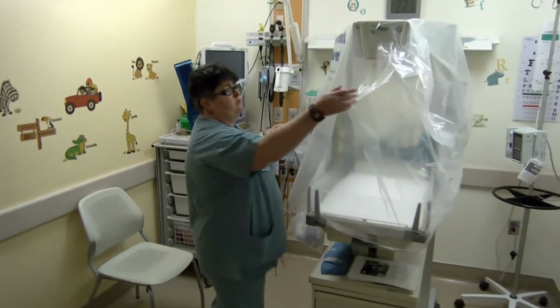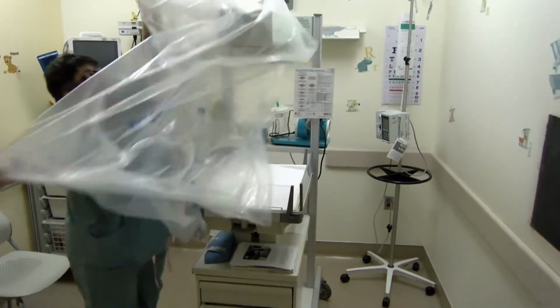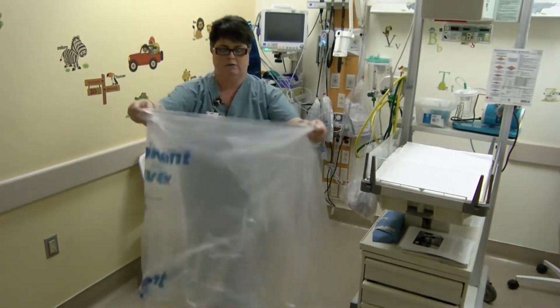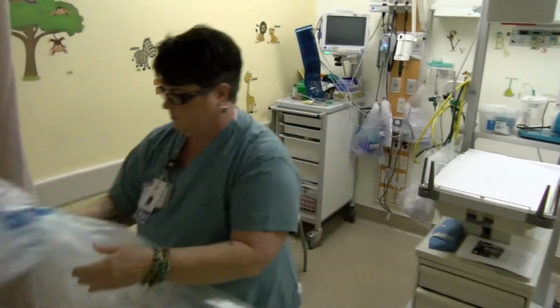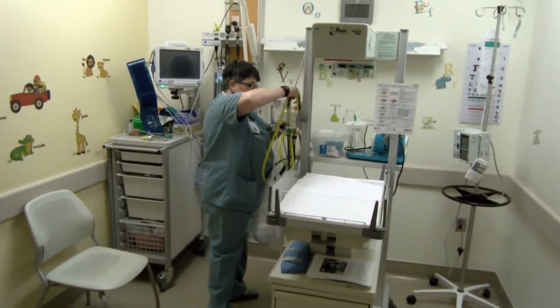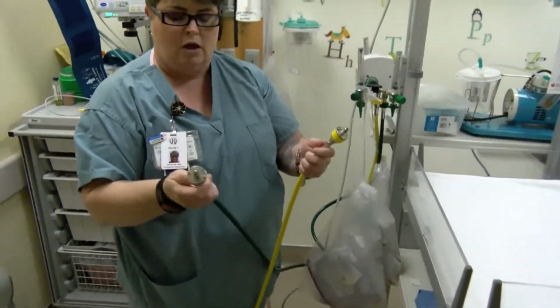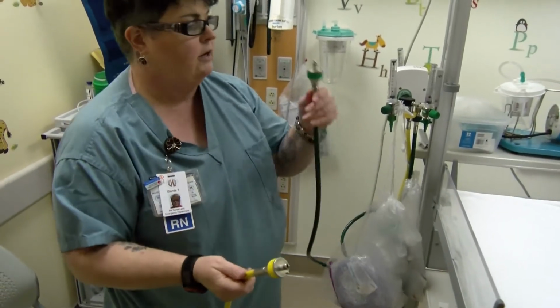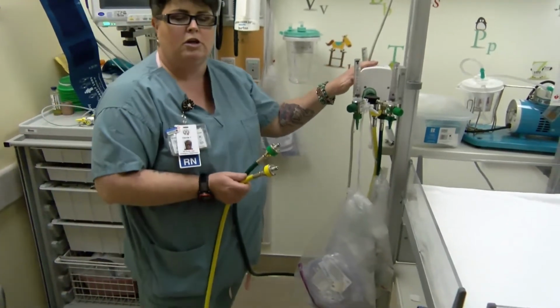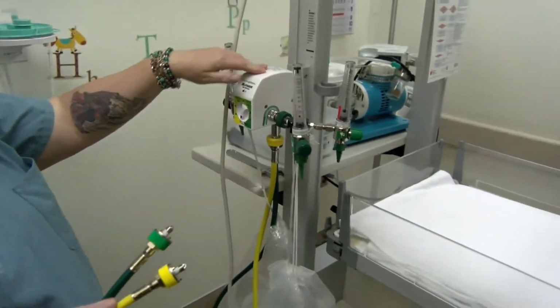You will first remove this out to your room. You will remove your dust cover from the top. This keeps the machine clean after it's been decontaminated between births. You have three important things that you must plug in. The first two are your lines. This is your medical air line. This is your oxygen line. You need to plug these in so you can use the blender to blend the oxygen level appropriately when you are resuscitating a newborn.